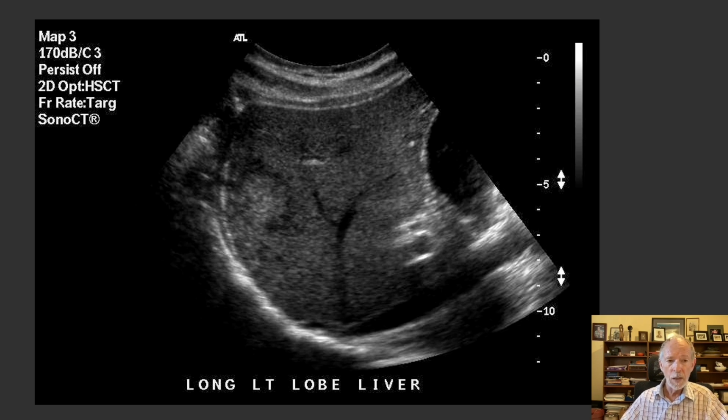This is because of the differences in the beam shape and pattern of the ultrasound beam, close up and deeper in. So what we're seeing is that the speckle pattern is in fact really an image artifact, but a very useful one because it allows us to see soft tissue.